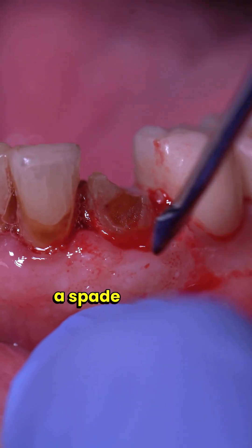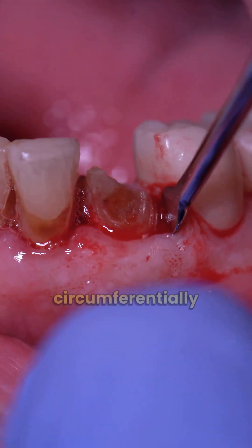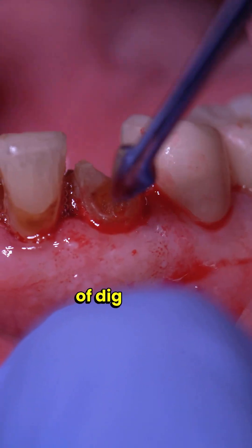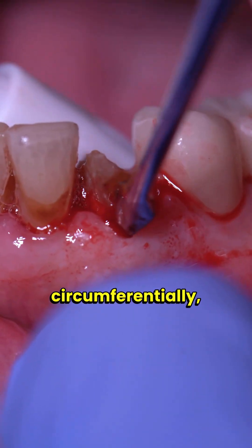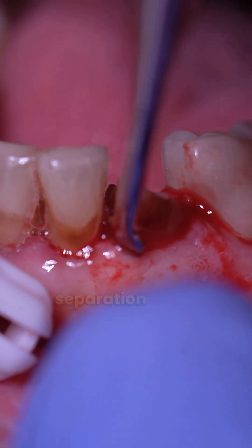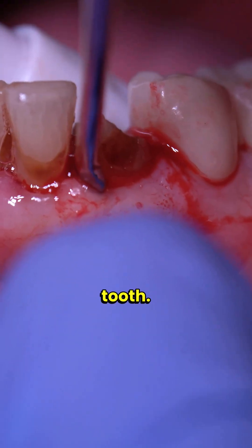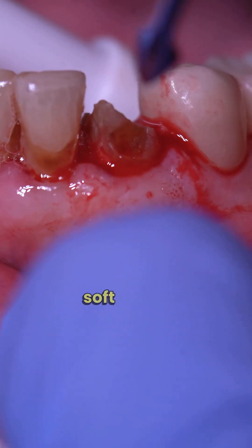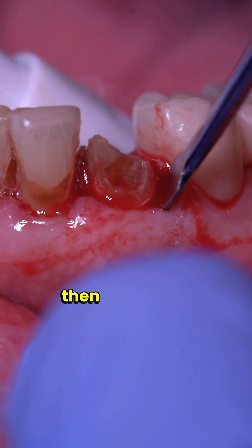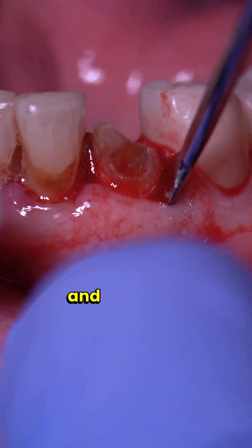What I'm using right here is a spade elevator. What we're doing is going circumferentially around the tooth, digging it in circumferentially, going bit by bit around the tooth making sure to get some separation of the soft tissue that's attached to that tooth. You're essentially just trying to separate that soft tissue from the tooth, and after you separate that, you're trying to wedge this between the bone and the tooth.